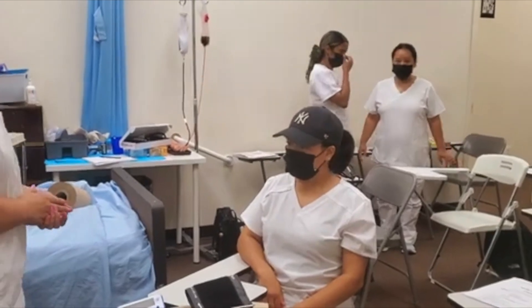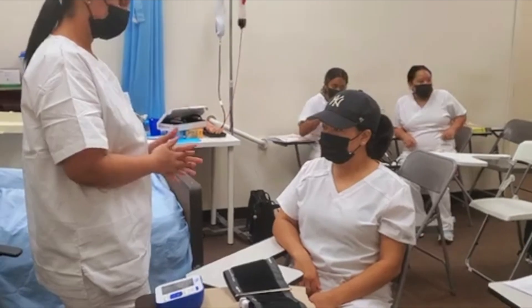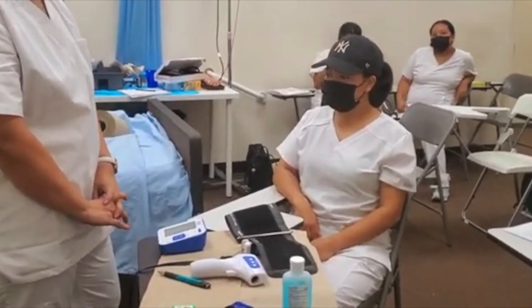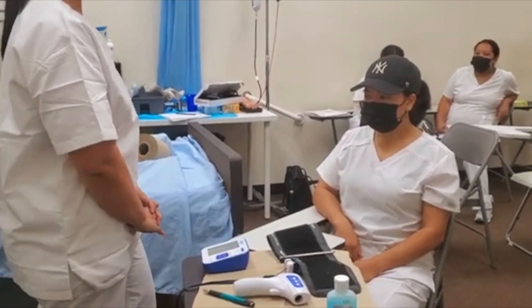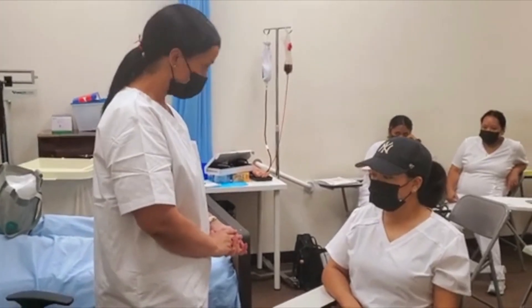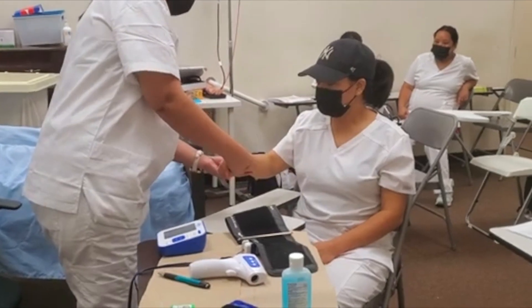Okay guys, good afternoon, welcome back to our YouTube channel. This is Miss Henderson. So today the students are doing vital signs and I'm going to make a small video about the vital signs. Go ahead, Giselle and Dabert.